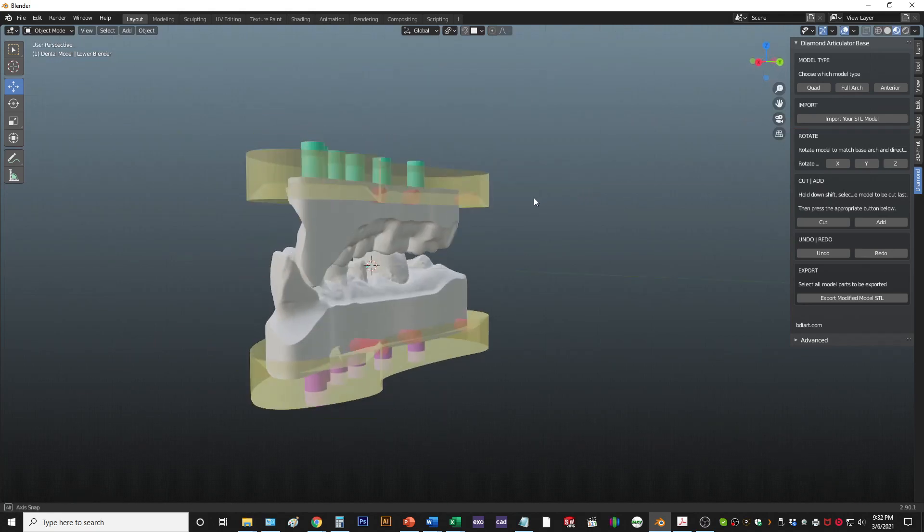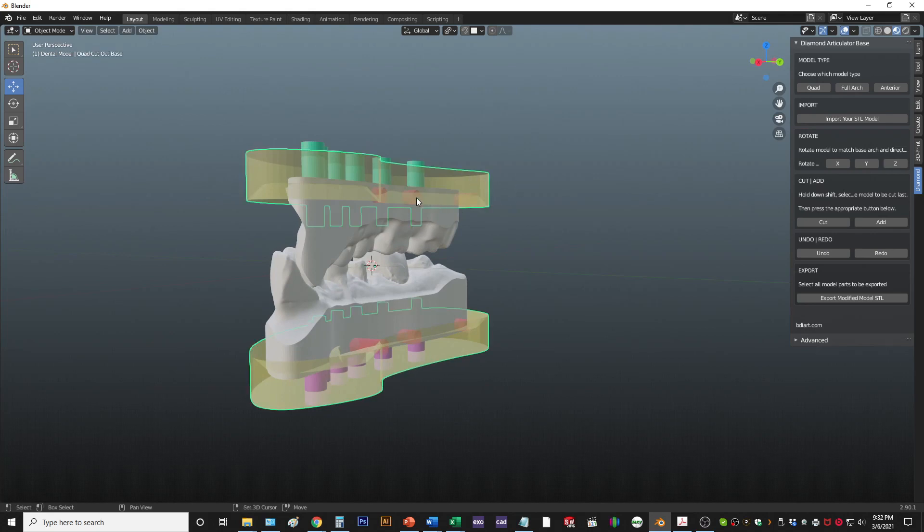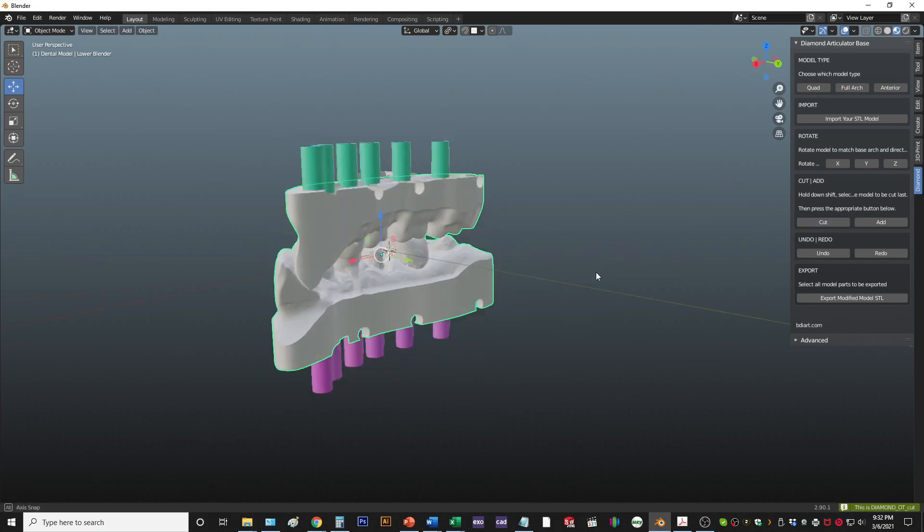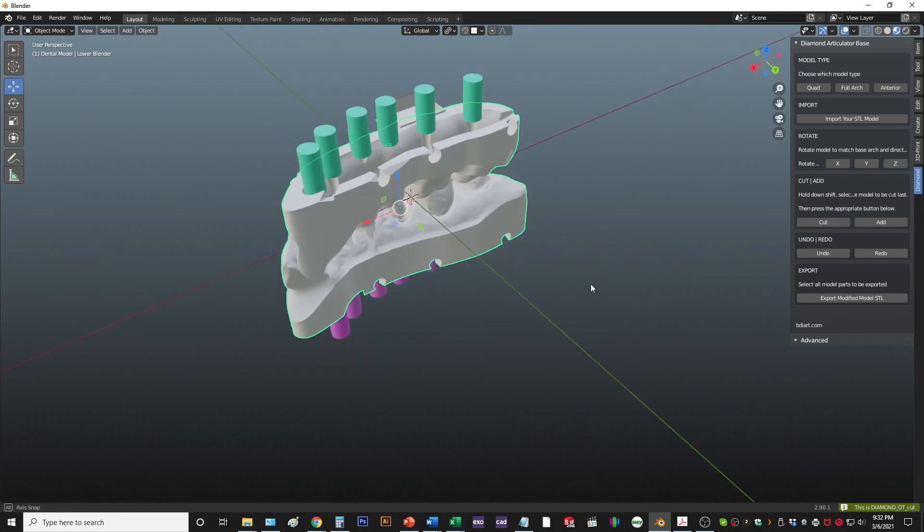Now you pick the base, and if you want the drain holes, and then the model. Whatever you picked last is going to cut. Then you hit cut, and all those things get cut out of the model.